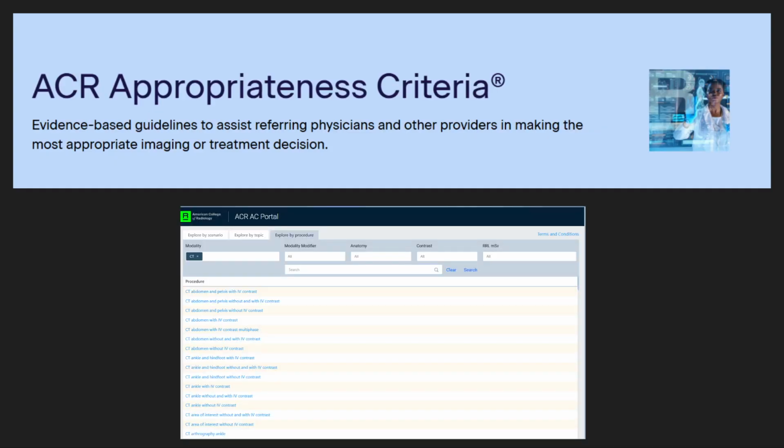Now, what about mesenteric ischemia? With mesenteric ischemia, you have to immediately order CT angiogram of the abdomen to basically exclude mesenteric ischemia. And of course, they have their own protocol known as the ischemic protocol. So for a case of mesenteric ischemia, CT angiogram of the abdomen. So this is pretty much the end of the presentation. These are all examples of the protocols for all different cases.